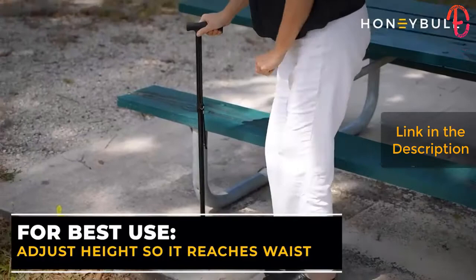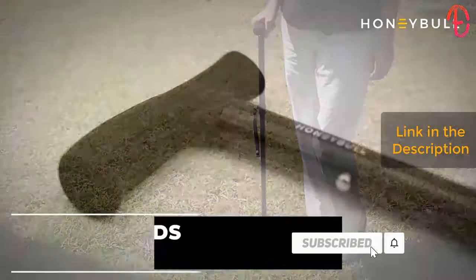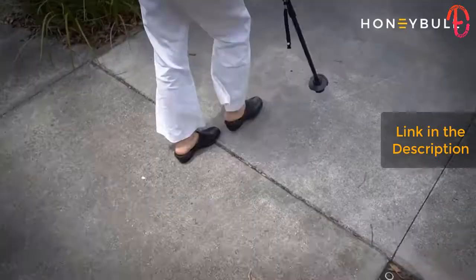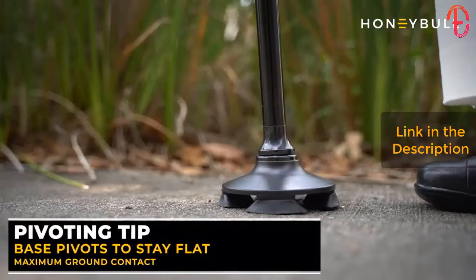For optimal use, adjust the height of the cane so that it reaches your waist or right at your belt line. The cane should be around half your height and will help provide the most support. The cane is adjustable from 30 to 37 inches, perfect for people who are five to six and a half feet tall.